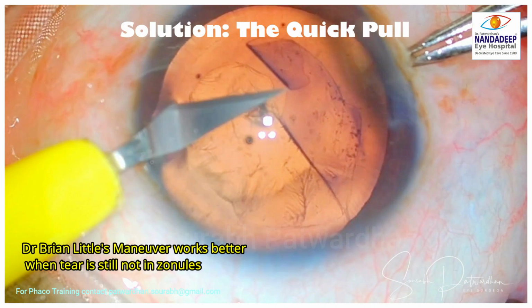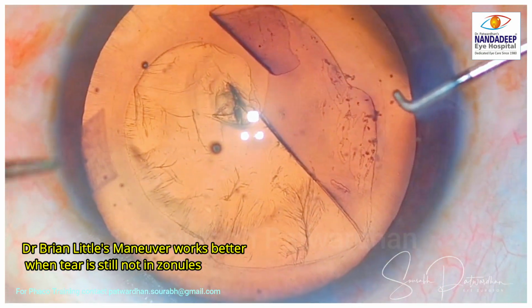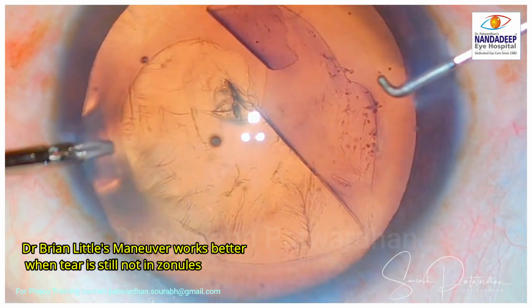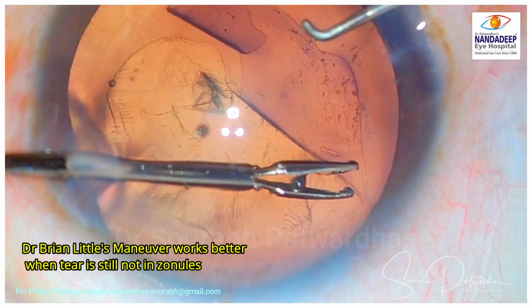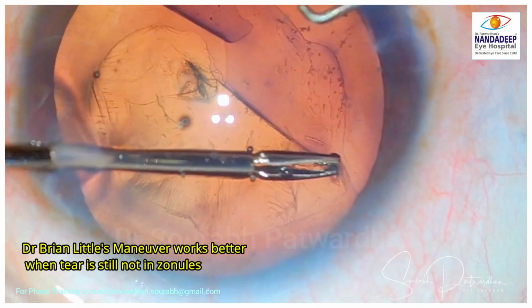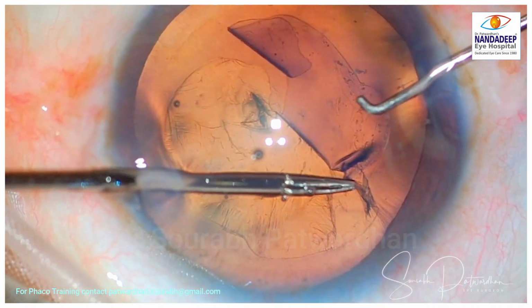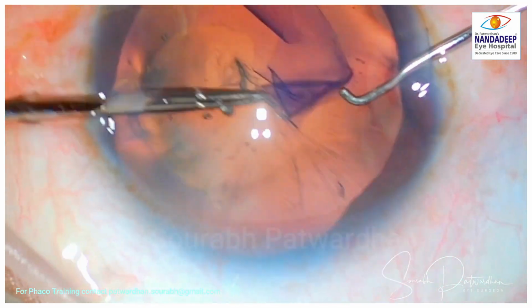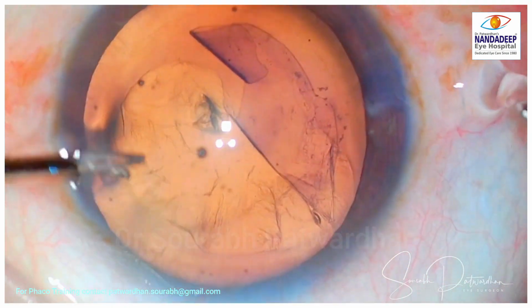Now the solution is quick pull. Dr. Brian Little maneuver works better when the tear has not still extended way into the zonules, while for these kind of situation this quick pull technique works better. Now watch how it is done. Approach has to be exactly opposite to the area where the tear has gone outwards, and that is the swift and quick pull which is must.